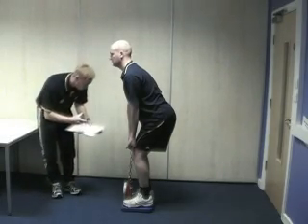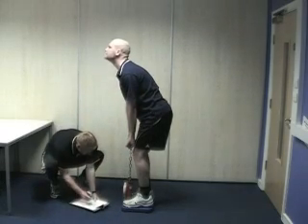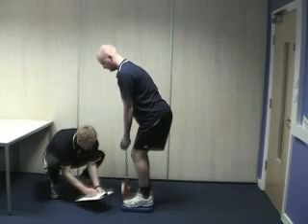Without leaning backward, the subject pulls the handlebar straight upwards using the back muscles. The subject is instructed to roll the shoulders backwards during the pull.